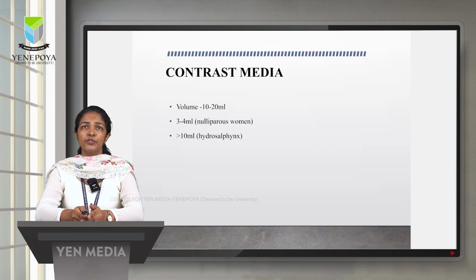In nulliparous women, who are females who have not had any childbirth, we can go for around 3 to 4 ml of contrast. And in the case of hydrosalpinx, which is a condition of fluid-filled, inflamed fallopian tubes, more than 10 ml of contrast media is necessary.